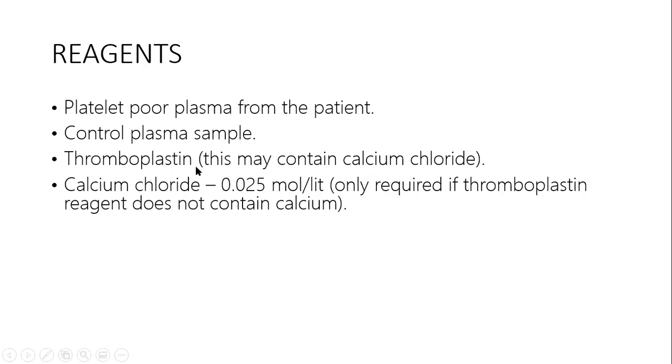We have the thromboplastine, which may contain calcium chloride, and yeah, the concentration of calcium chloride should be 0.025 moles per liter, and this is only required if thromboplastine reagent does not contain calcium.